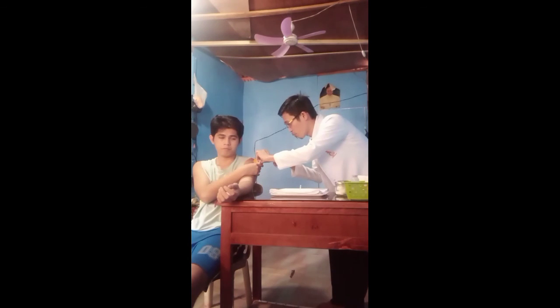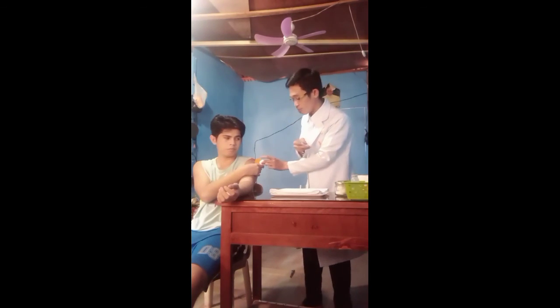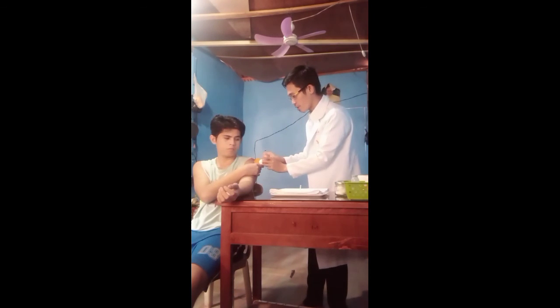Gently remove the needle from your patient. Do not massage. Apply gentle pressure, do not massage, to prevent underlying tissue damage. Also help the patient to a comfortable position to give the patient a sense of well-being.